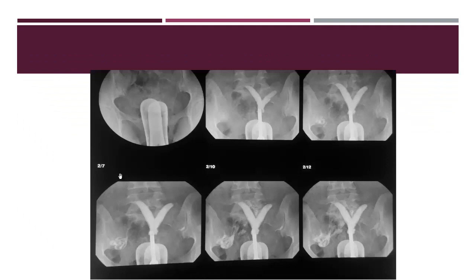Another case, duplicated uterine cavity. I think this is a case of secondary infertility, because we see here the site of the cesarean section, the wedge-shaped defect. So this is a duplicated cavity. From here I can say it is septate because there is intravasation in the myometrium in that part. But again, better to look by ultrasound.